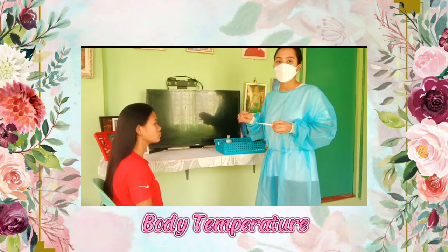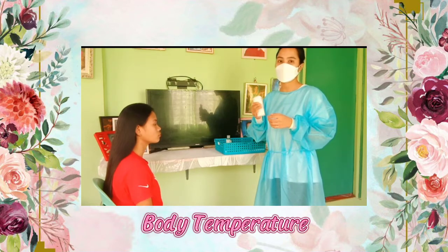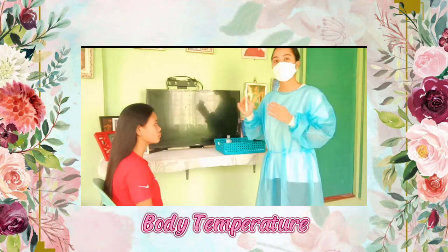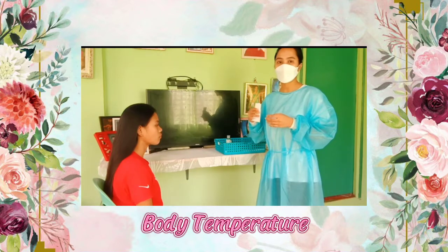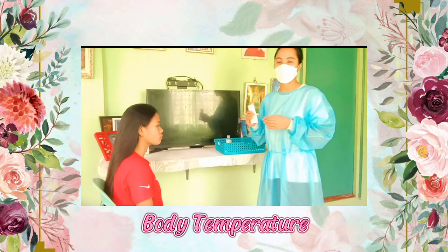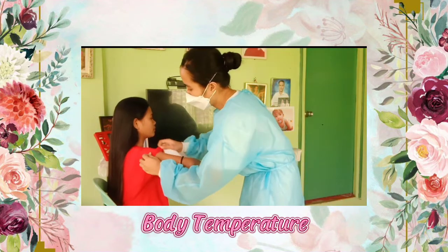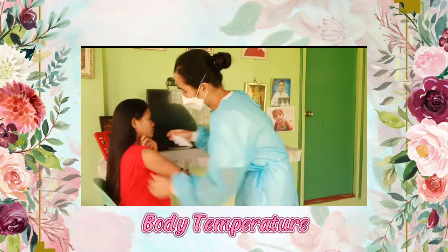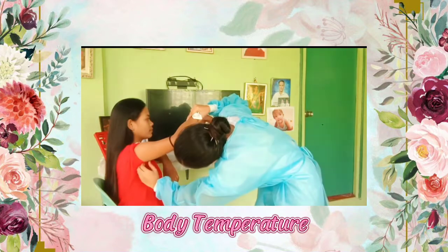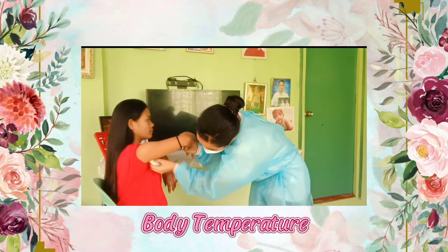After preparing the thermometer, ask the patient to raise her arm away from the torso. Inspect for skin lesions or excessive perspiration. Do not use the axilla if skin lesions are present because local temperature may be altered or the area may be painful to touch. So, ma'am, can you raise your arm, please? There are no lesions present, so we're just going to pat dry the axillary site.